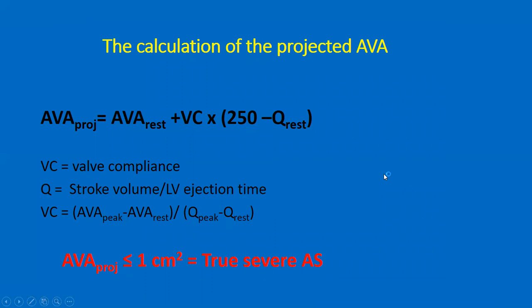More and more, the calculated projected aortic valve area enters clinical practice because it has a greater value than the non-projected one.